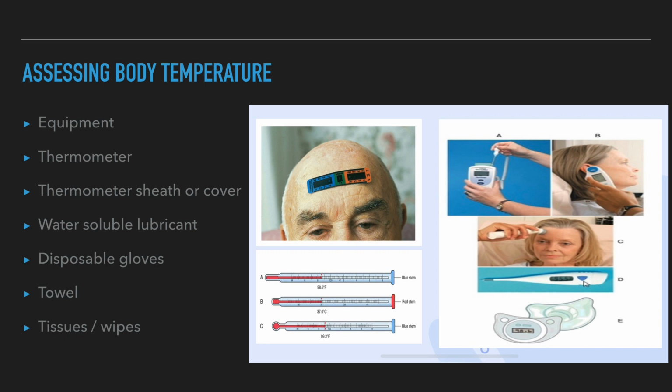1. Electronic thermometers. Healthcare facilities use the electronic thermometer extensively. Many types are on the market, but all have similar characteristics. The thermometer consists of a battery-powered display unit and a temperature-sensitive probe connected to the display unit by a thin cord. A disposable plastic sheath covers the probe to prevent the transmission of infection. Electronic thermometers provide readings in less than 60 seconds. When used orally, they are most accurate if placed in the sublingual pocket.